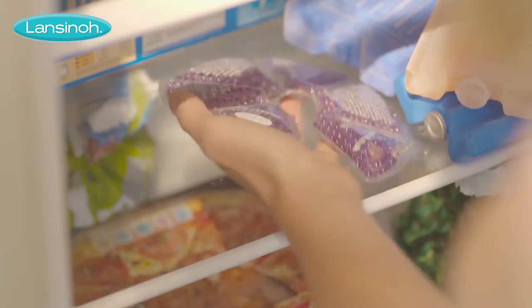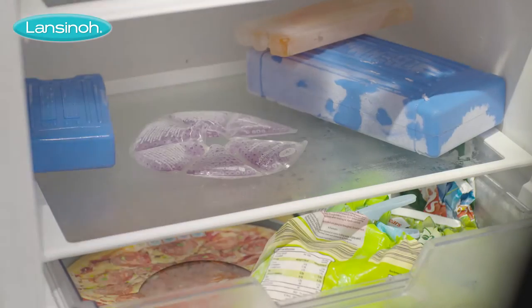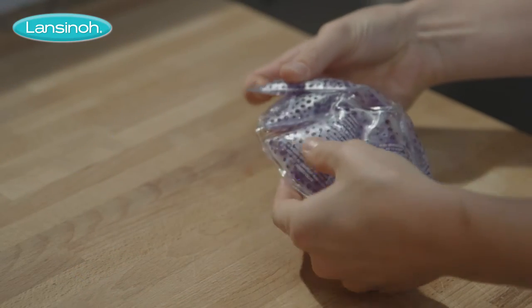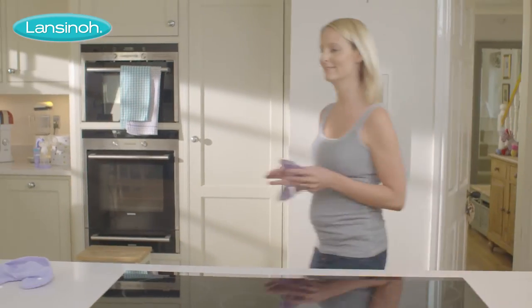Used cold, it is great for relieving pain and swelling due to engorgement. Keep a treatment pack in the freezer for at least 2 hours and it's ready to use. Even when frozen, the Therapearl pack is still flexible and will contour easily around your breast.